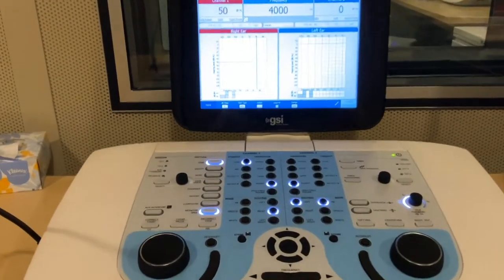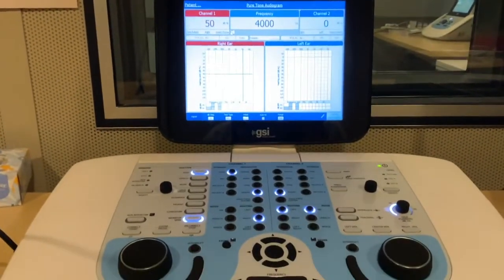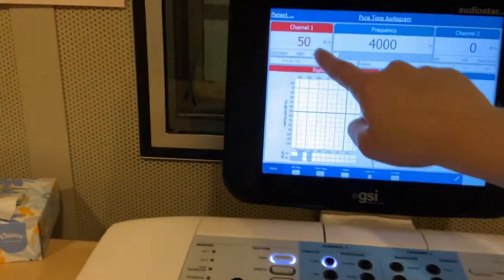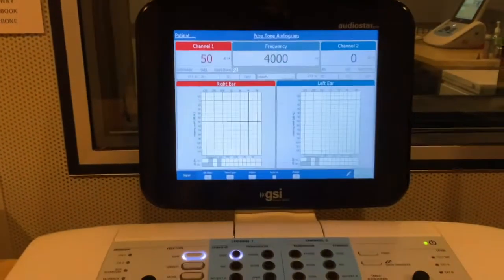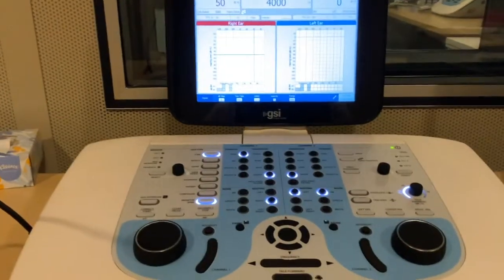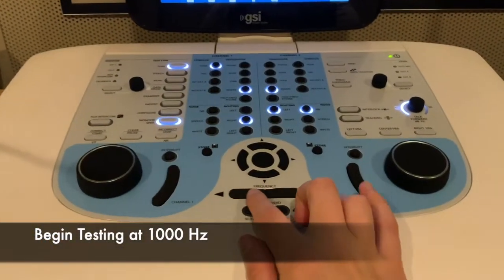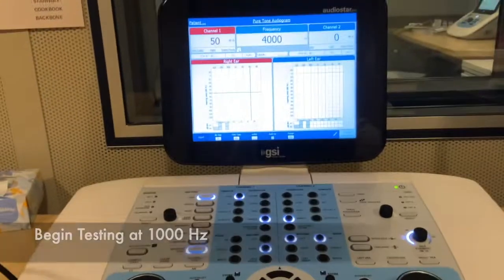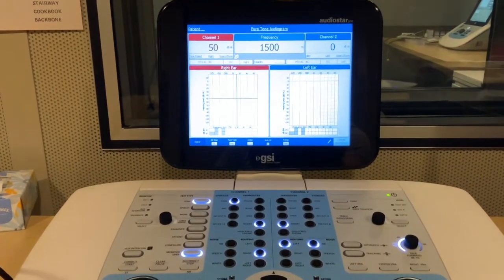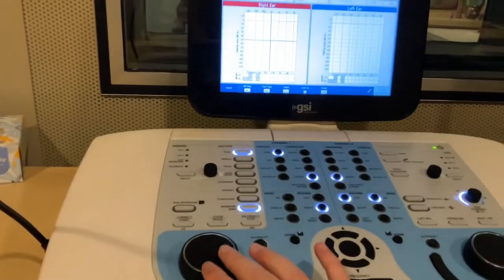Okay, so now that we set those first settings up over here, we want to make sure that our frequency up here and our intensity or our decibel level volume are set to the correct settings to start the test. So to begin, we usually start at 1000 hertz. So using these frequency buttons here on the audiometer, I will go down to 1000 and then set the intensity level.